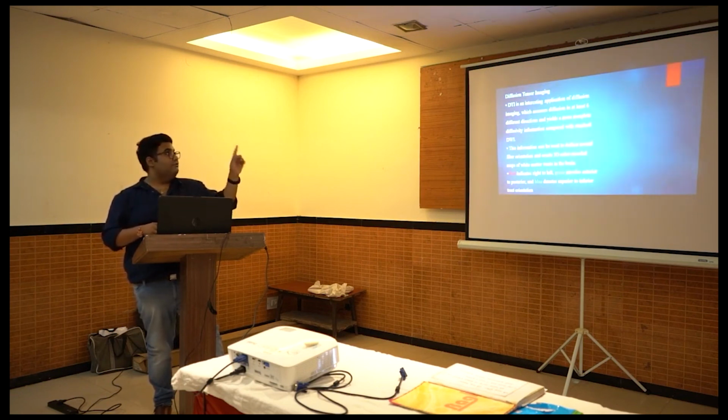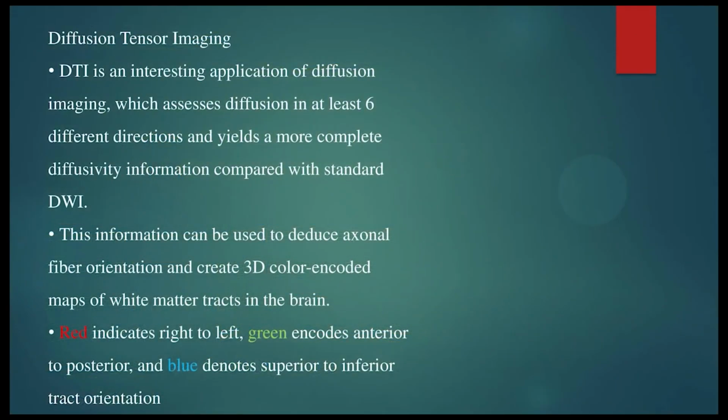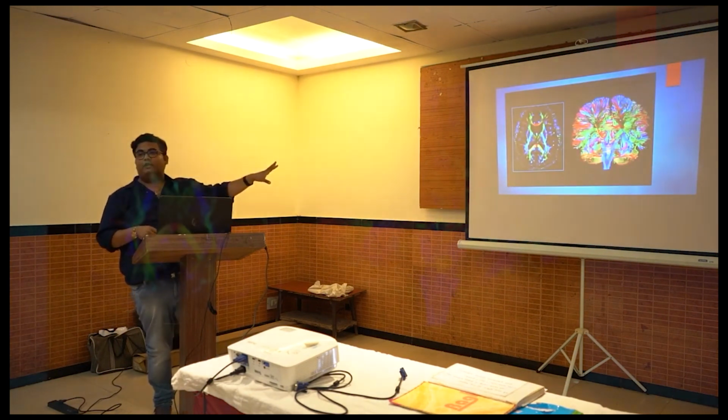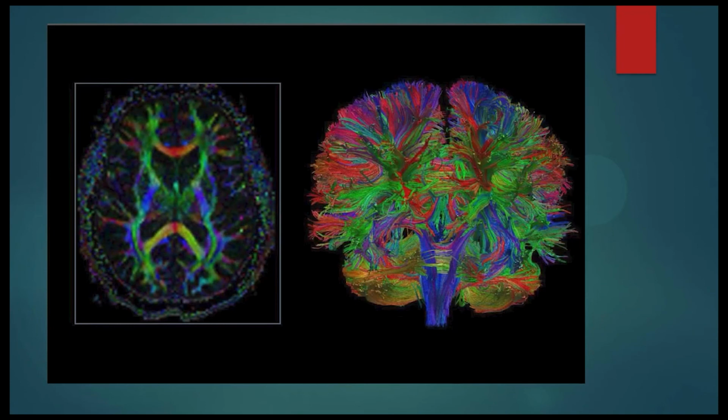In diffusion tensor imaging, there is anisotropy in the water molecules, where the water is flowing in a direction. So the water will move in a direction. Those are the white matter tracts. So from right to left, from up to down, that's how water is moving along the myelin. We are exploiting that property of water, the anisotropy, to create the images. This is the type of image we will get. These are the white matter tracts. It's also called MRI tractography because we are imaging the tracts.